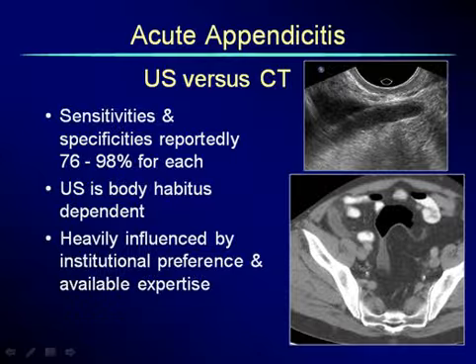Ultrasound is limited by a number of factors. We all know about bone and gas, etc., but it's probably best decided by the body habitus of the patient. So if it's a thin, young patient, it should do quite well. In an obese, heavier patient, it does not do very well at all. Those should go to CT.